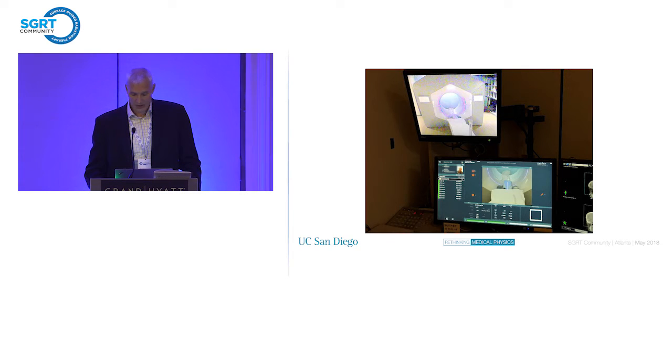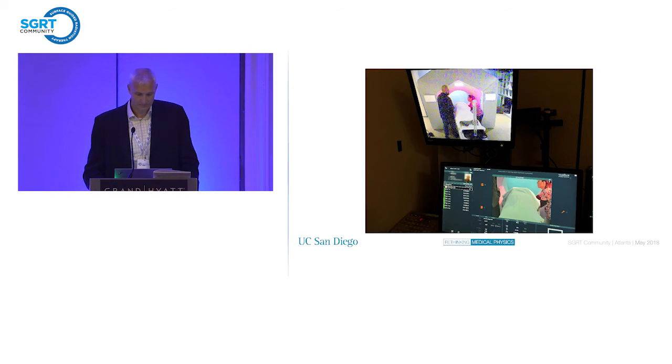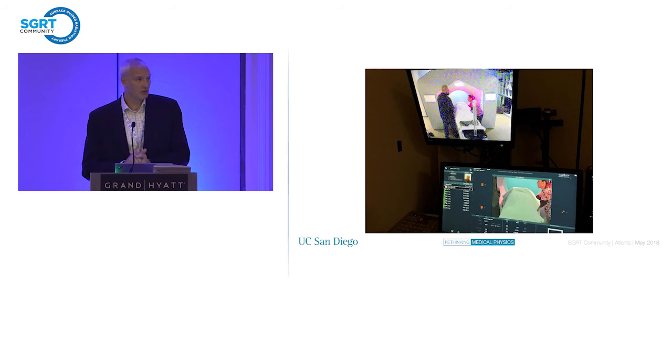And so the first thing that happens, just like a regular case, you open up the patient in Align RT at the treatment machine. The therapists go into the room and open up the patient on the Halcyon system, get the immobilization stuff ready, and then the patient is placed on the table and they get the initial positioning set up. Again, all this happens outside of the treatment bore, so the patient is not inside the treatment bore. And once they get the patient basically set up, they make sure the mask is off, and then one of the therapists will turn on the Align RT system and start monitoring the patient. And they make their large adjustments with the Align RT system guiding the adjustments for the patient.